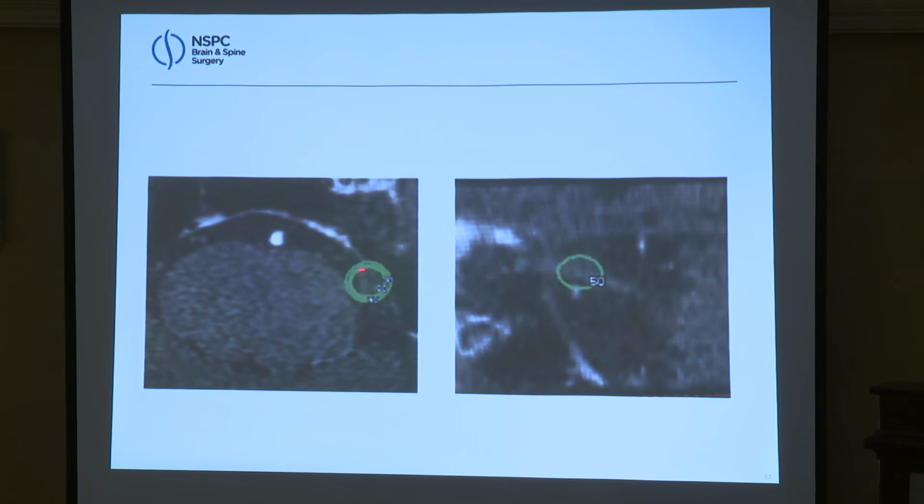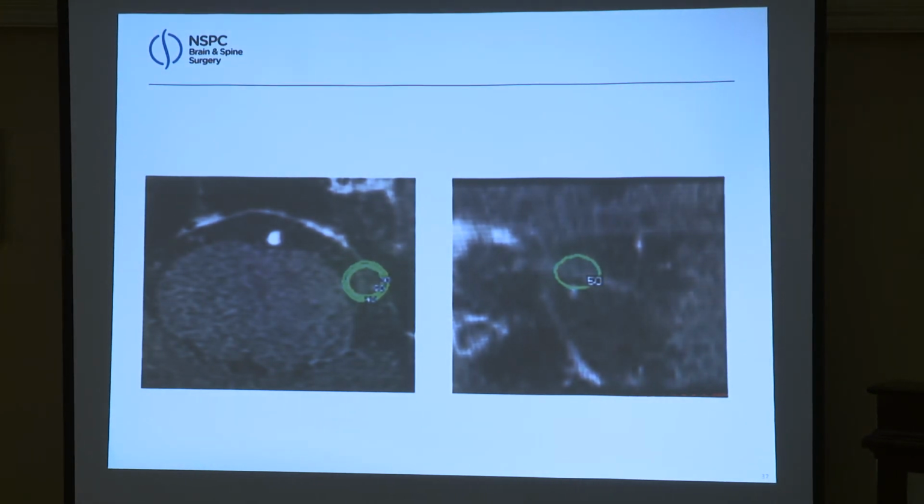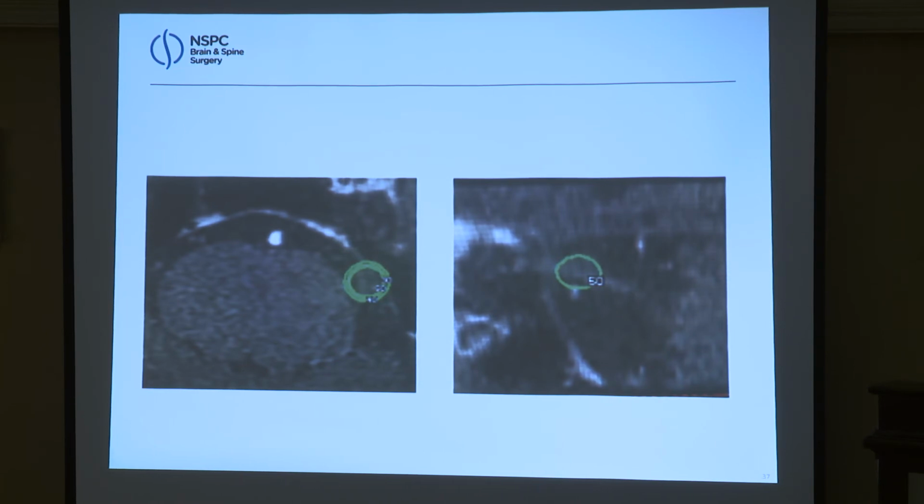This is another person that I recently saw in the office this past year. He had bad left-sided trigeminal neuralgia, V2, failed medical and conservative measures. He had like heart stents and heart operations. He was, I think, 64 at the time, or in his 60s, and I recently saw him. He's 15 years out, coming to see me for something else. I said, "How's your face, man?" He's like, "That's gone." And he's on no medicines, and people can do really nicely.